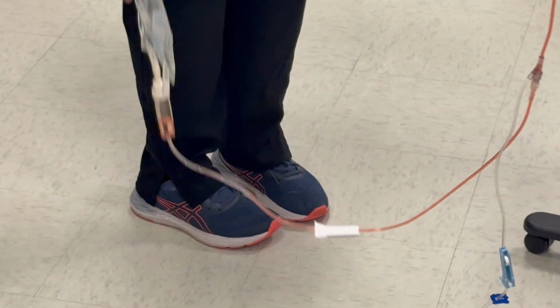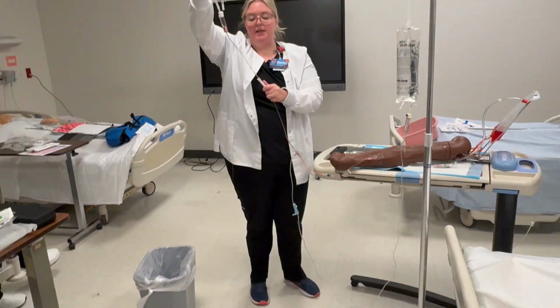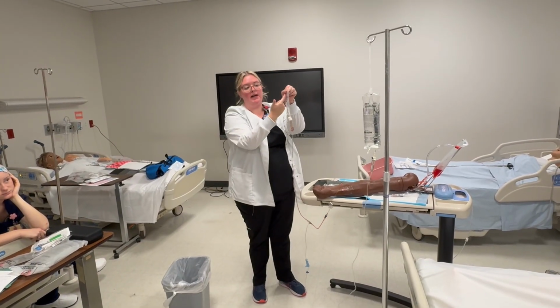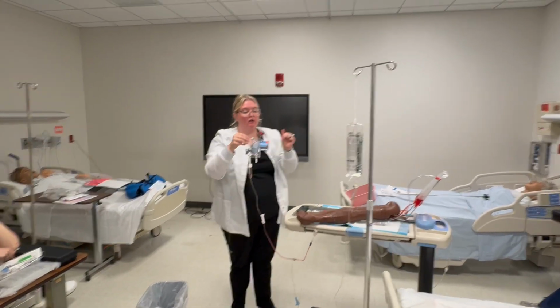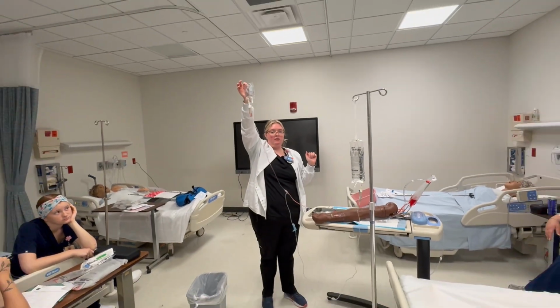Is the purpose of priming to get the air out of the tube? You're getting the air out of the tube, yes, and you're priming with this solution. And the air, what's happening is the air is going up to the top of this bag. So this is what I meant by magic trick. To make it go faster, you're gonna hold it lower. To make it go slower, you're gonna hold it up, okay?